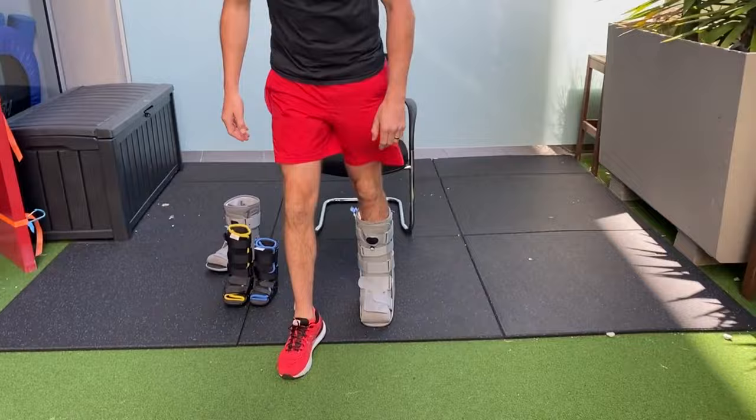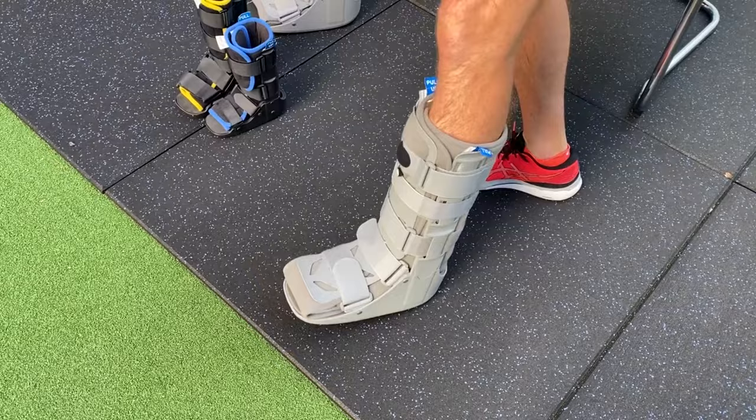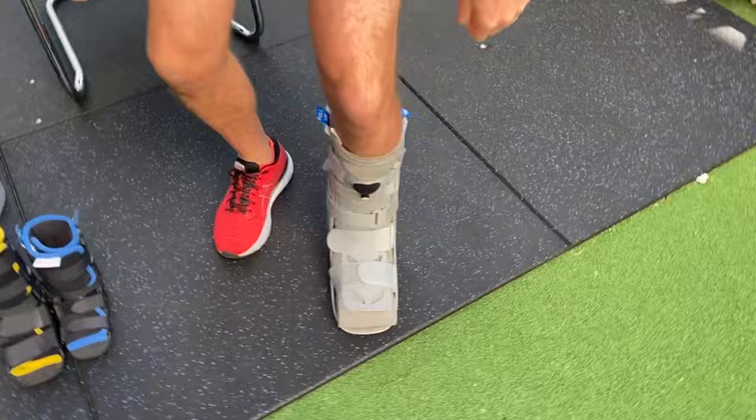Walking in the boot can feel hard at first but you'll get used to it — it's actually very comfortable and you'll feel almost no pain. If the boot is moving and rocking as you walk, you haven't tightened it up enough. Get a snug fit so movement is limited and your ankle is properly supported.